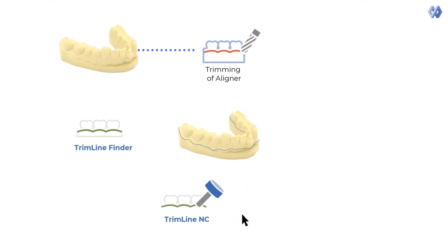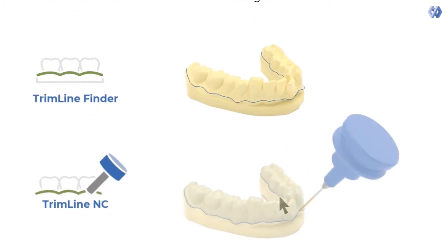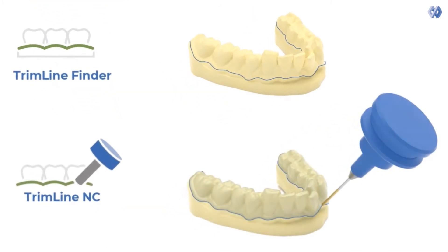ModuleWorks Trimline NC eliminates another laborious manual process. It helps automate the process of trimming the aligner itself, using either a CNC machine or a robotic arm.